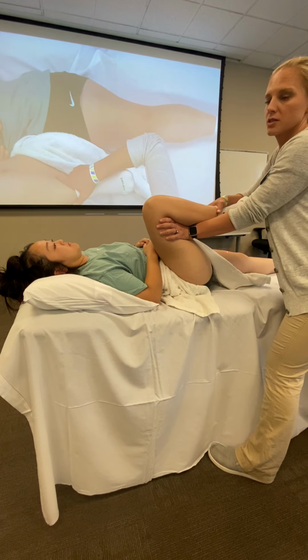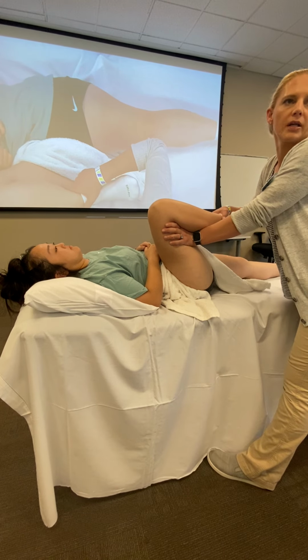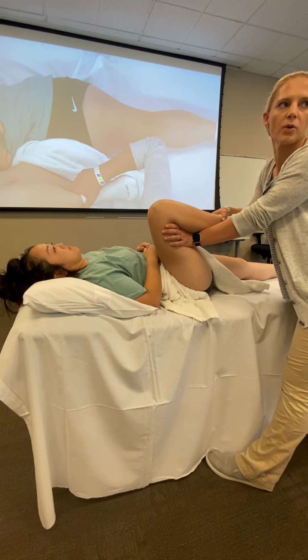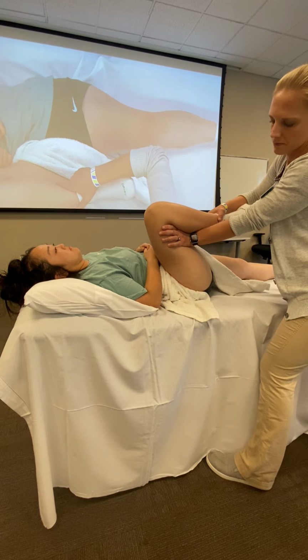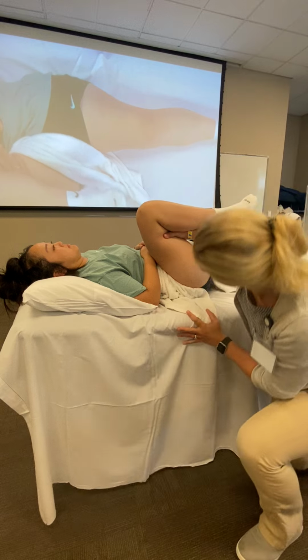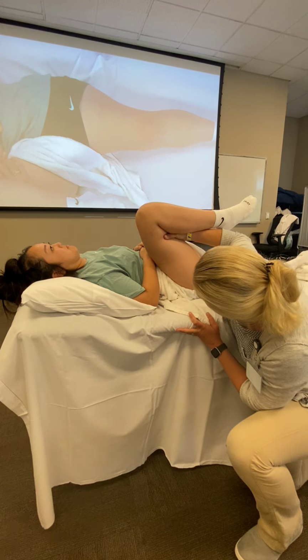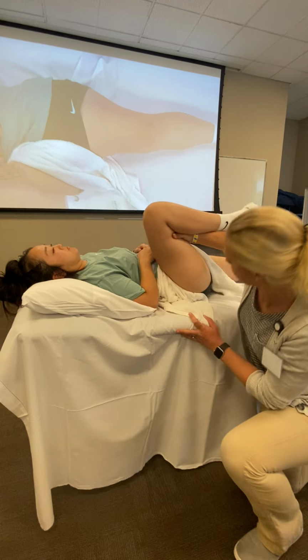And this will probably be a soft end feel. Some people it might be firm depending on body size and structure, but just know it's probably a soft end feel. Any pain? So look in here. To me, that looks like it is about, I'll say 130. Any pain? All right.